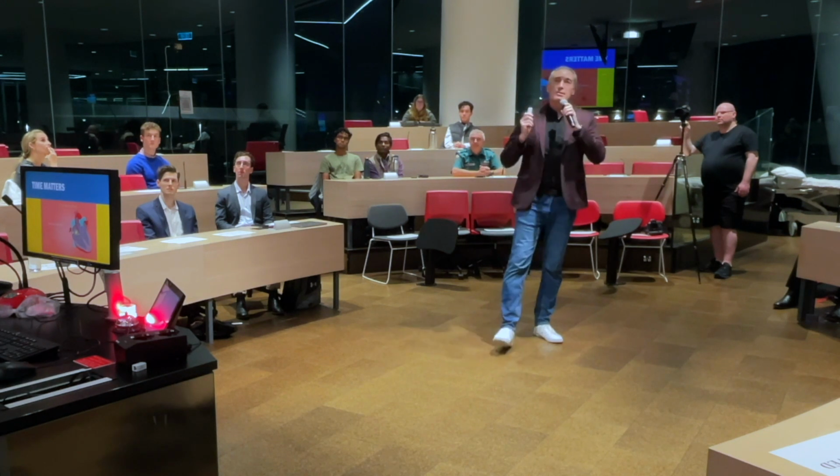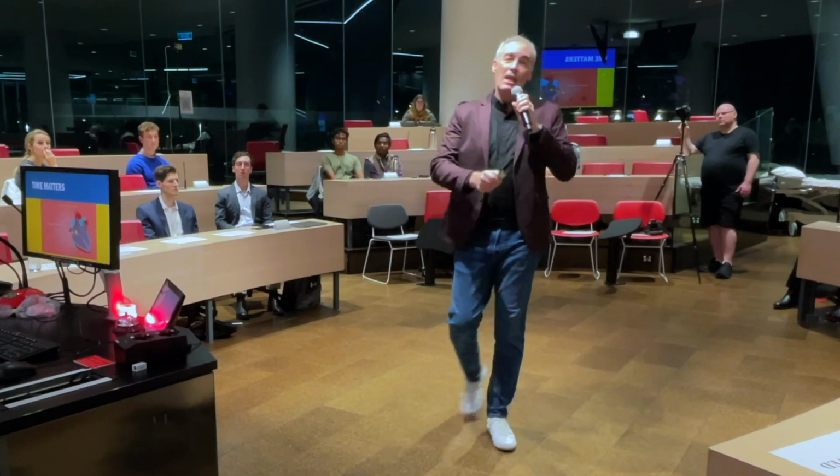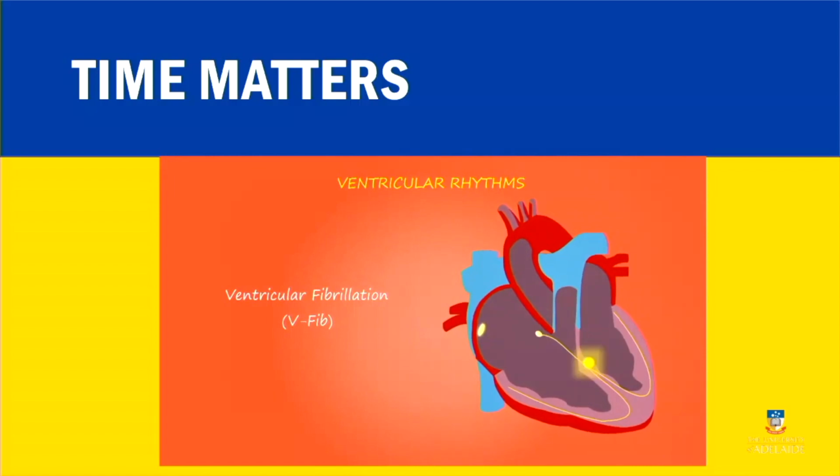In cardiac arrest, time matters. You'll notice that previous slide said, if an AED is placed on a patient within 3 to 5 minutes, time is the crucial thing. And this is why time matters, because somebody who's in cardiac arrest, that electrical problem of their heart is causing absolute chaos.